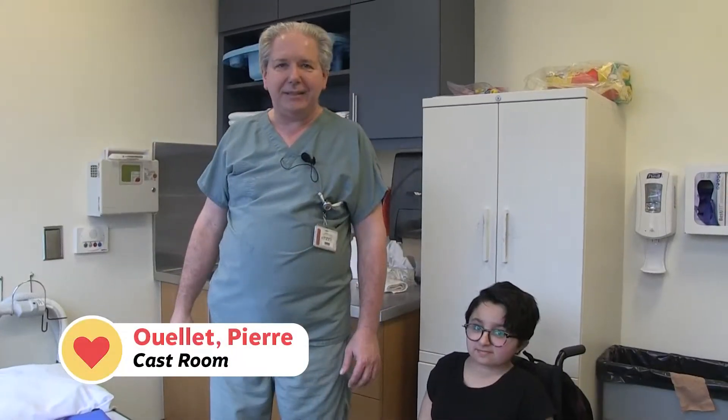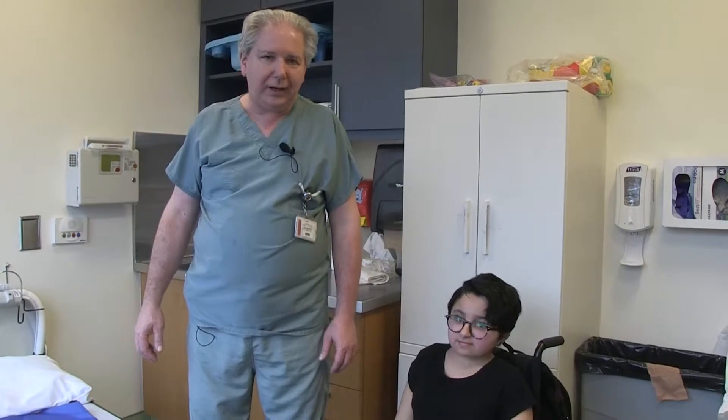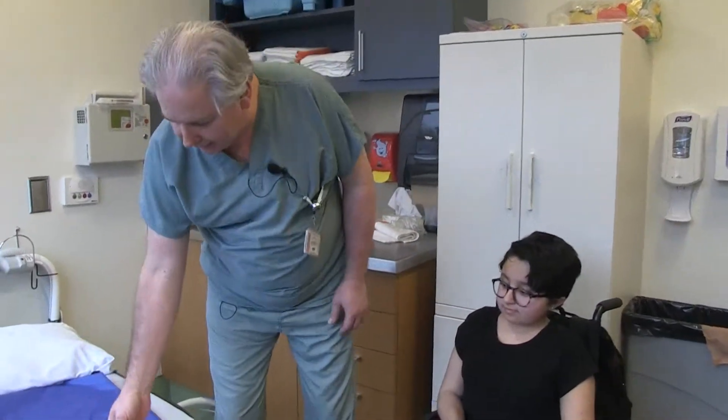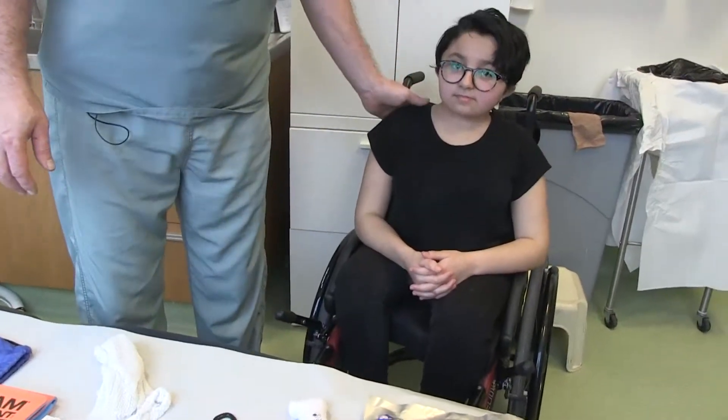Hi, my name is Pierre Ouellette. I'm a nurse and orthopedic technician at the Shriners Hospital for Children Canada. Today we will demonstrate the use of the SAM splint in order to immobilize an arm fracture. Kenza will be our model for this video.